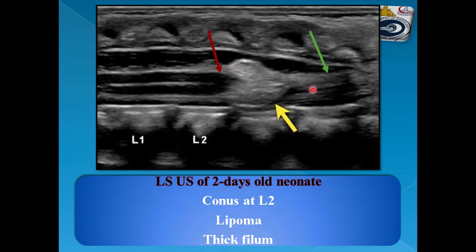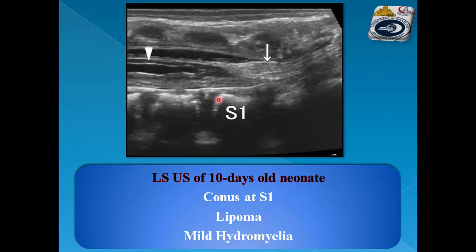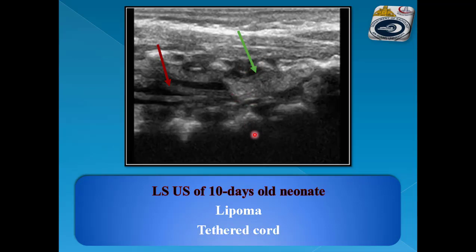This example on LS ultrasound shows the conus at L2 at its normal position, yet it is buried within a spinal lipoma, and there is an associated thick filum terminale. Another example: the lipoma — the cord ends at S1 denoting tethered cord, and there is mild hydromyelia with mild dilatation of the central spinal canal. Another example shows the spinal lipoma with a tethered cord.